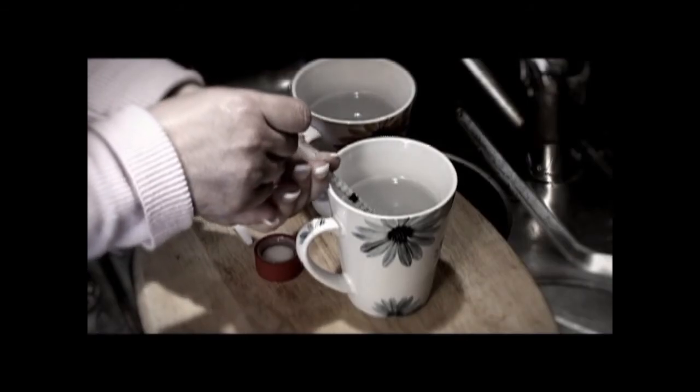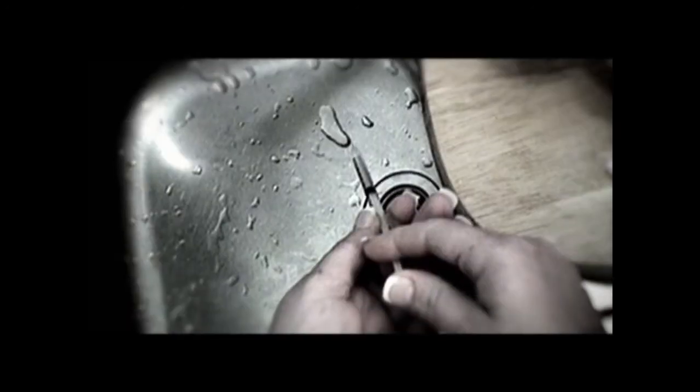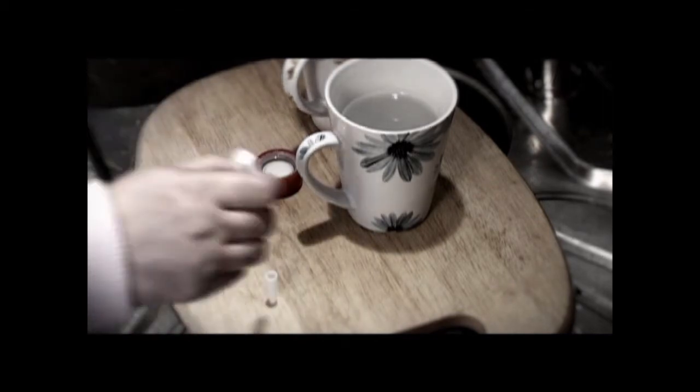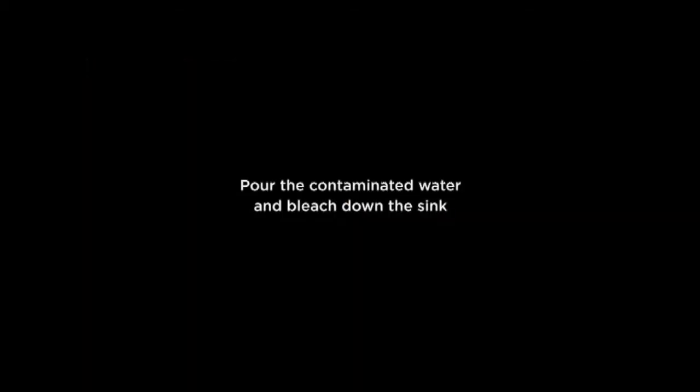Draw up water from the second cup and empty the syringe into the sink. Carefully put the cap back on the syringe. Then pour the contaminated water and bleach down the sink.